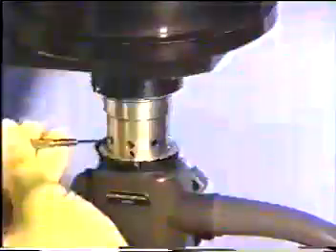Fix the eccentric pin for tilt adjustment with a screwdriver and adjust focusing by rotating collimation adjustment eccentric pin. Fasten the set screw for tilt adjustment. Fasten the set screw for focusing adjustment. After fastening 2 set screws, make sure focus adjustment is OK at the white line, moving the focusing ring of JA3006.